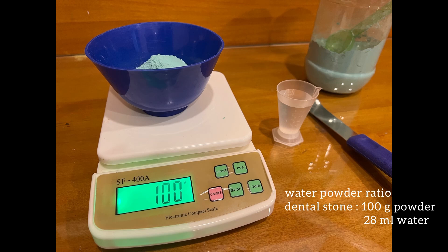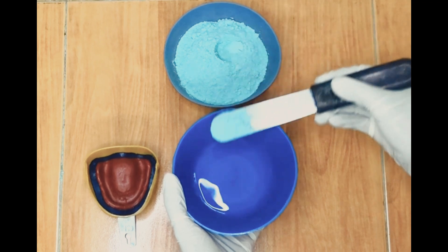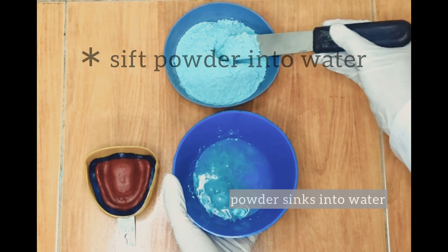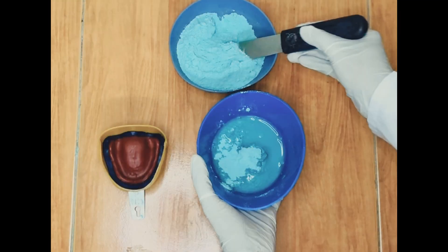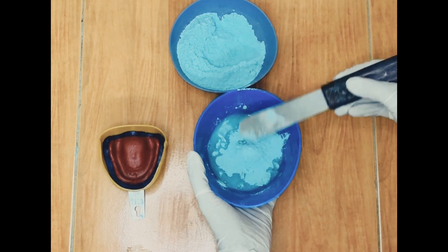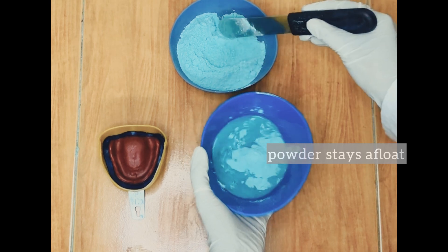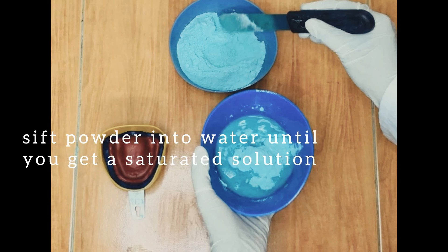Weigh the powder and liquid according to the water-powder ratio, or you can proceed as follows: always sift powder into the water and allow it to sink to the bottom. Never drop it in huge lumps as this can entrap a lot of air bubbles. Keep sifting powder into the water until the added powder no longer sinks and starts to stay afloat. This ensures that the water is saturated with the powder, which in turn guarantees a cast with good physical properties.